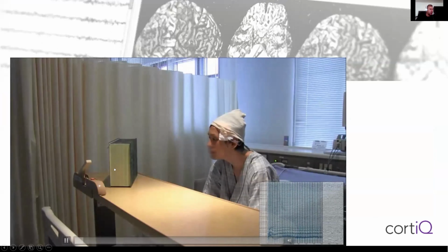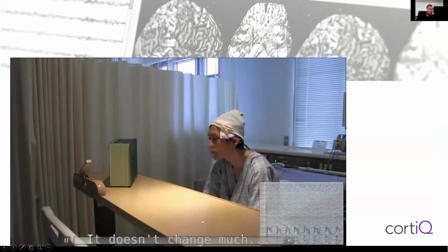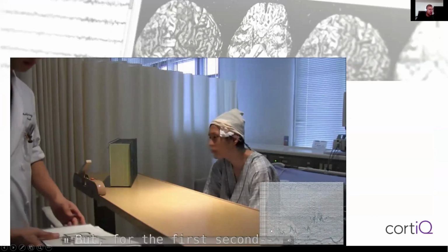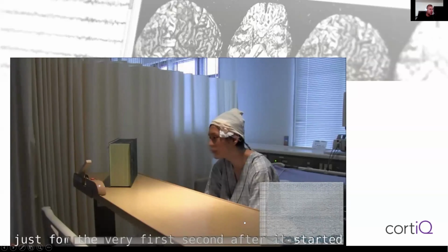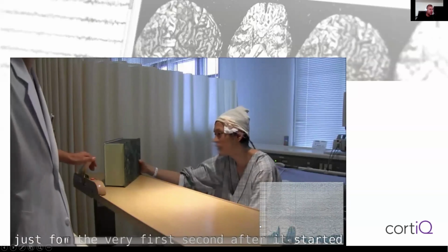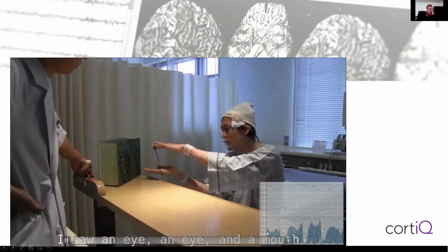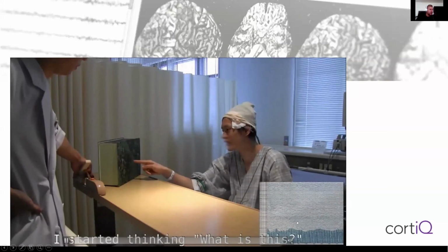So here this is now a box, and the patient looks at the pattern of the box, and here we saw the stimulation artifact, and this is already an after discharge that we talked about before. So here we are stimulating with 8 milliamperes into 1.5 millimeter electrode discs, and this is the maximum current that we can apply for this patient.